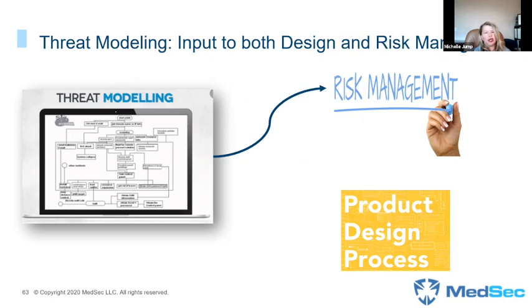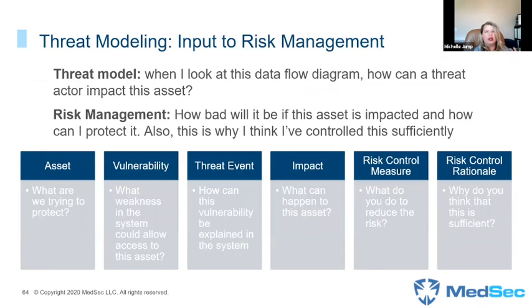Now we're going to talk a little bit more nitty gritty about how threat modeling pulls into risk management, because that does require some thought. I'm first going to tell you, people can kind of cut the line of what belongs in the threat model and what belongs in the risk management process. You can cut that cloth in several different places. I'll tell you where I believe the cutoff is, from my experience and what I do.